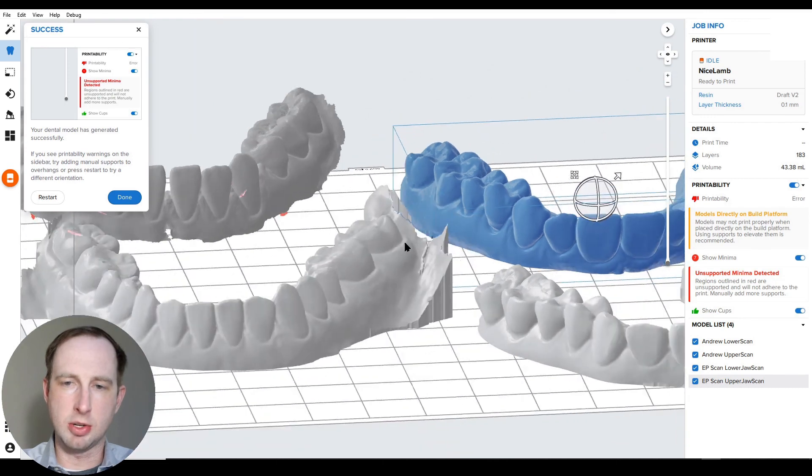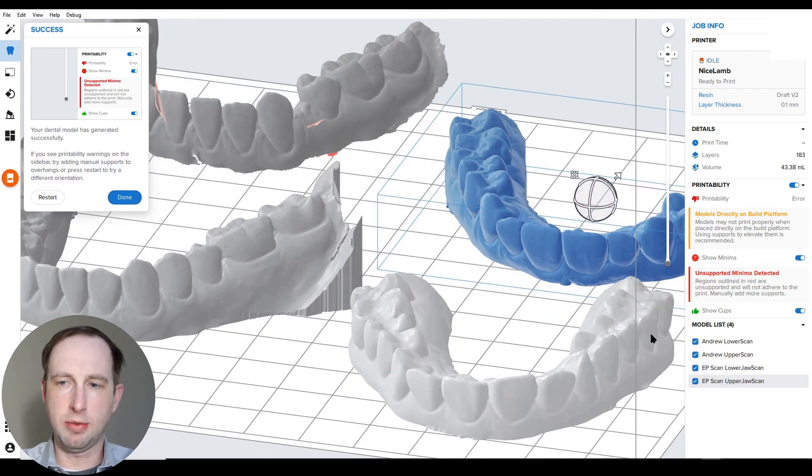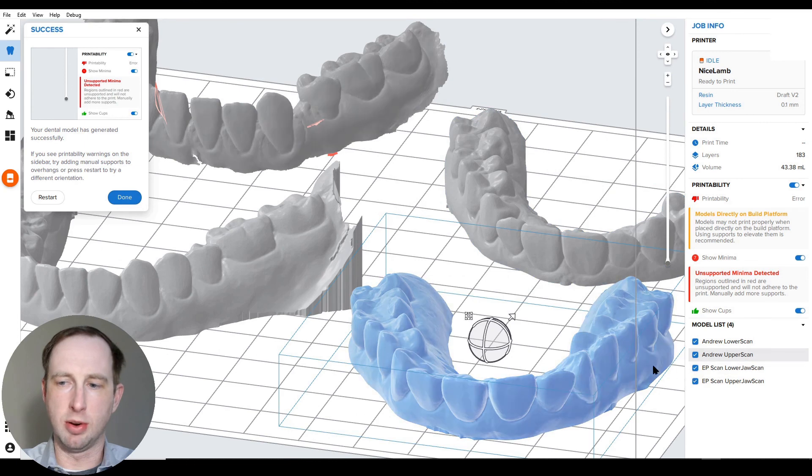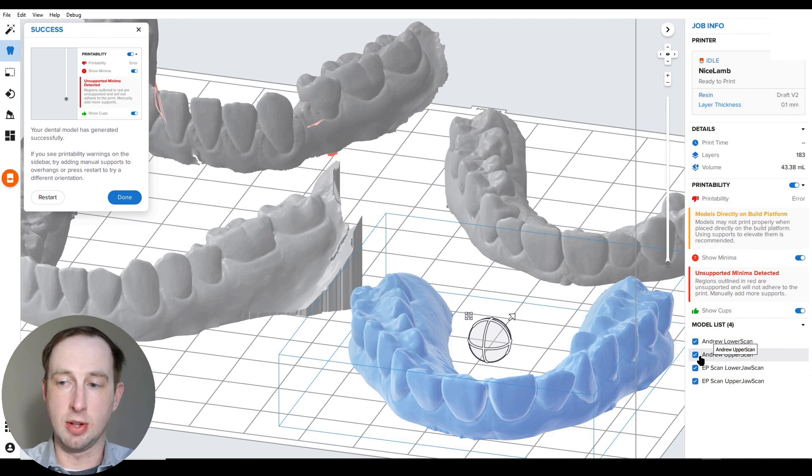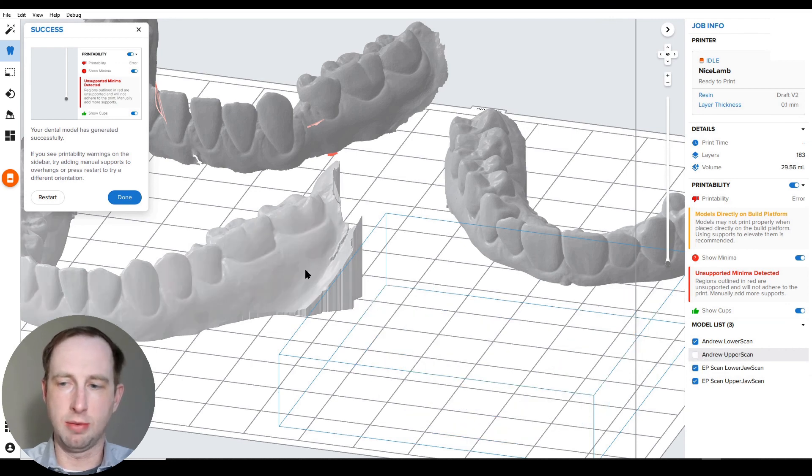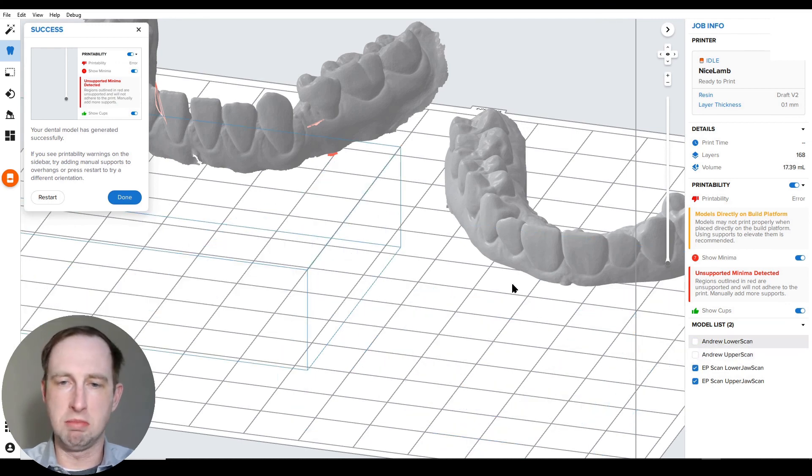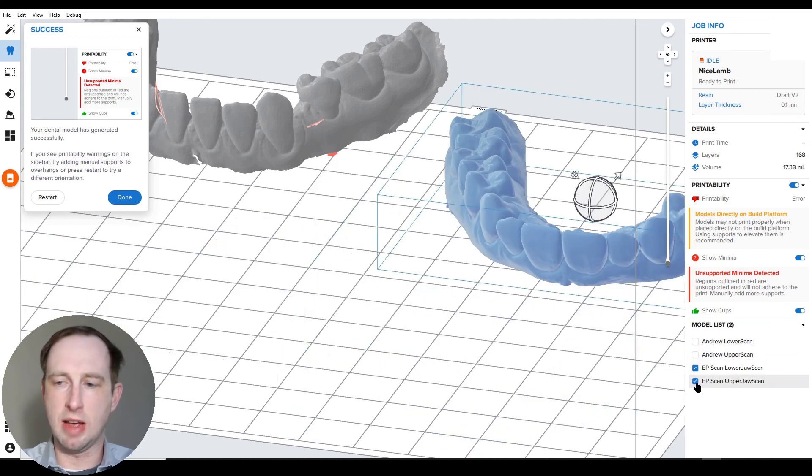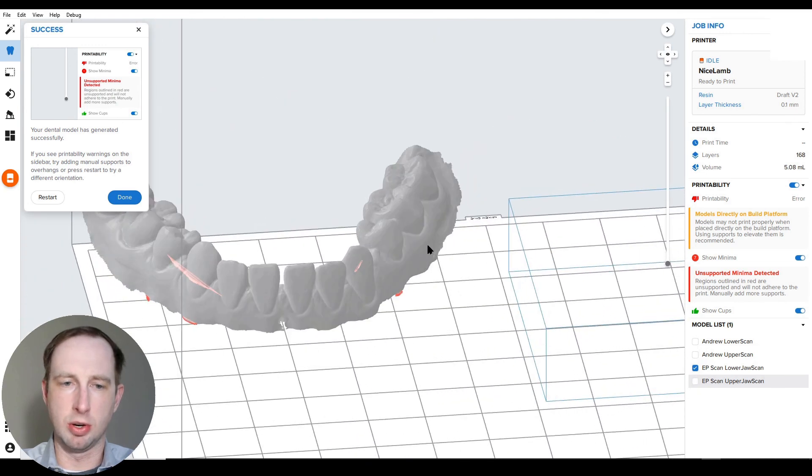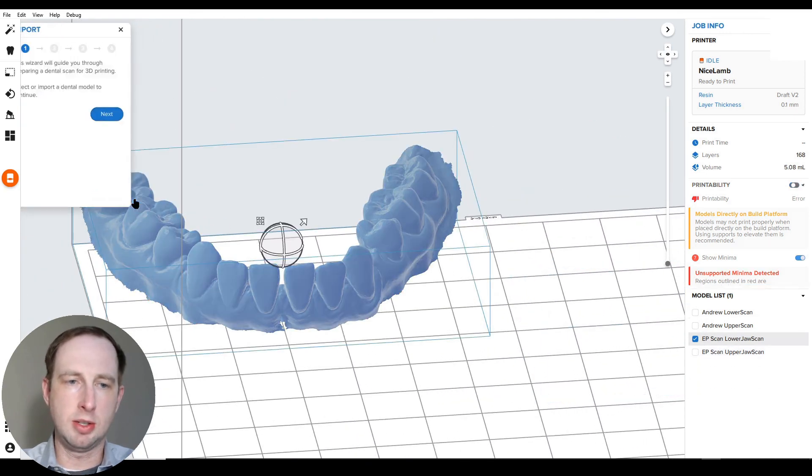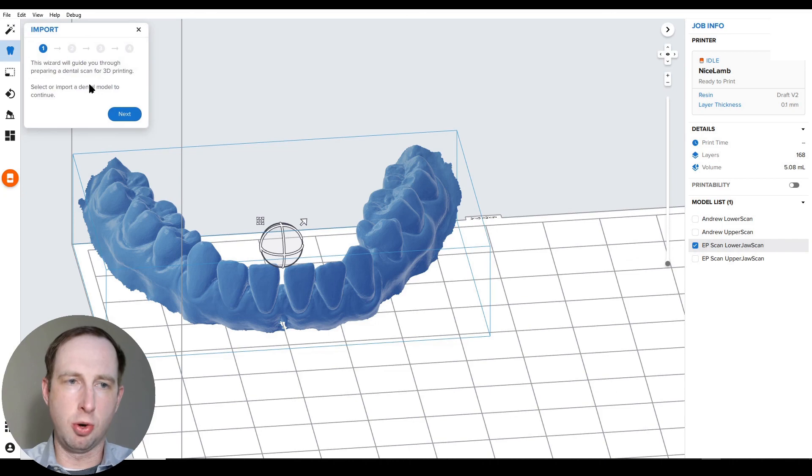And of course, like I mentioned earlier, say this is starting to get cluttered, or you're doing even more than this, just turn off the ones that are already built. So you can see here with this one selected, if you look at the bottom right, this is now selected in the model list, just turn that off. It just gives you an easier navigation of the space, and you can see clearer what you're doing next. All right, so we hit done, scan the model once more.